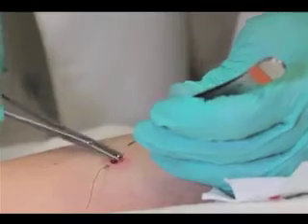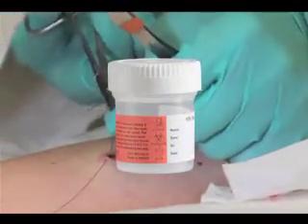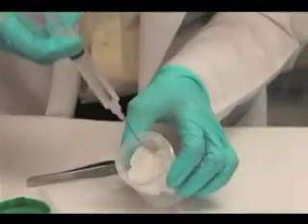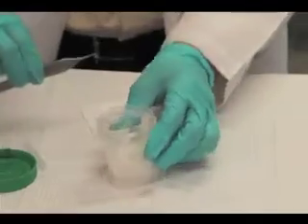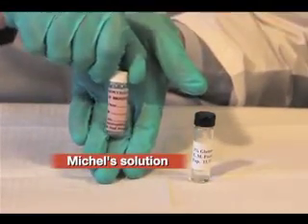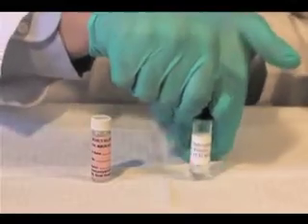The vast majority of skin biopsies are transported in formalin for routine hematoxylin and eosin staining. If a tissue culture is needed, sterile technique should be used, and the specimen must be placed on a 2x2 inch piece of sterile gauze pre-moistened with 10 cc's of non-bacteriostatic saline inside a sterile cup such as a urine sample container. For immunofluorescence studies, Michel's solution containing ammonium sulfate is used as transport medium. Glutaraldehyde is used as transport medium for electron microscopy studies.